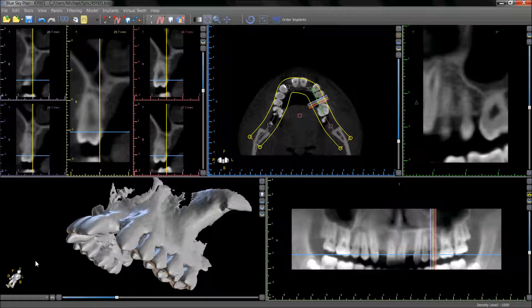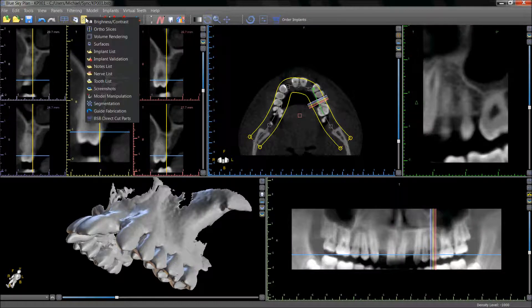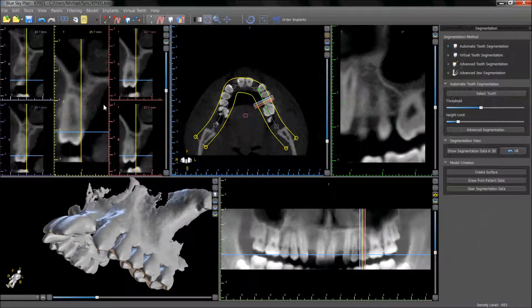Blue Sky Plan contains powerful tooth segmentation options. The segmentation panel can be opened by going to the panel drop down and choosing segmentation.